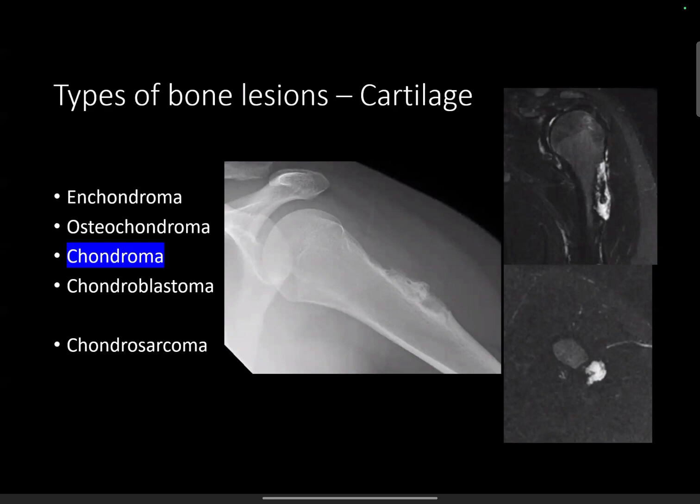I find that it depends if you're only doing X-ray alone or if you have MR. Because if you see an ill-defined sclerotic lesion and you're going between chronic osteo and osteosarcoma, I would recommend an MR. And on MR, it's very easy to tell the difference. Because on MR, usually there's a marrow replacing lesion with a soft tissue mass, whereas osteo wouldn't have that. And so I think MR is really how you tell the difference.